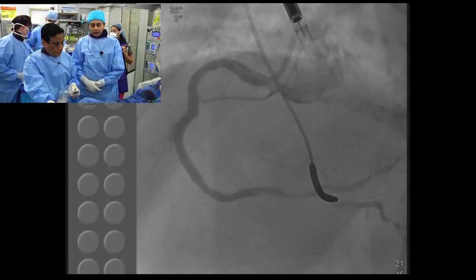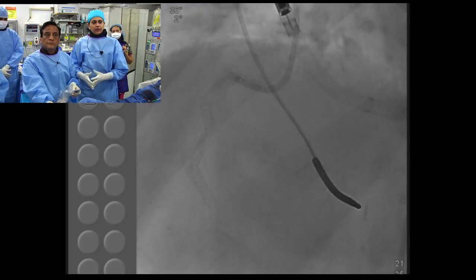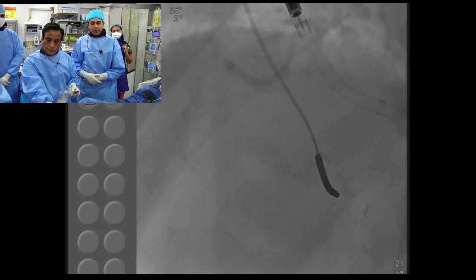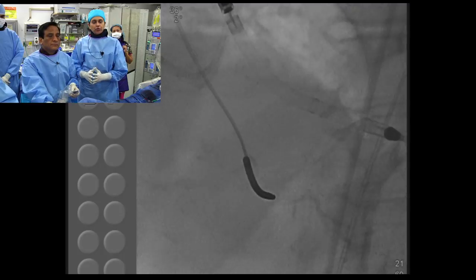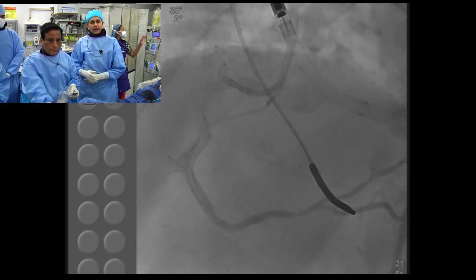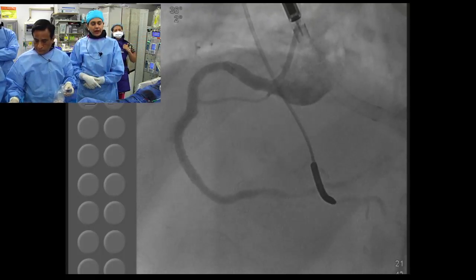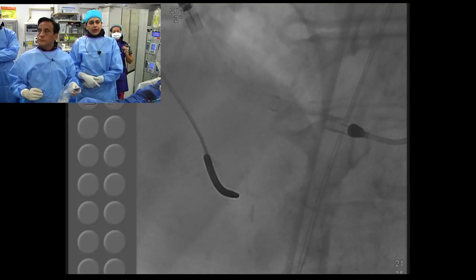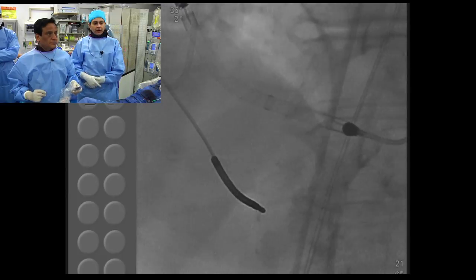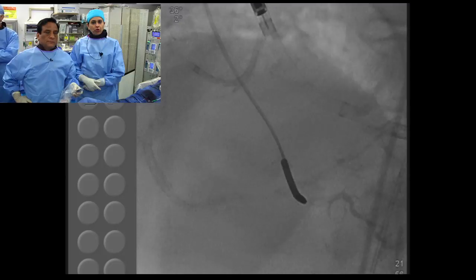Like I mentioned, this is mid-LAD, mid-RCA, PDA, diagonal, this kind of disease, and borderline cases. And when in doubt, and more important, is most patients who have come with a CT scan. This is a very common scenario: a patient asymptomatic, going for some kind of test, and then had a CTA. Now you find three-vessel disease. The question is what to do. Whenever in doubt, the best defense is to do an FFR, and if it's physiologically positive, then you go ahead with the PCI.